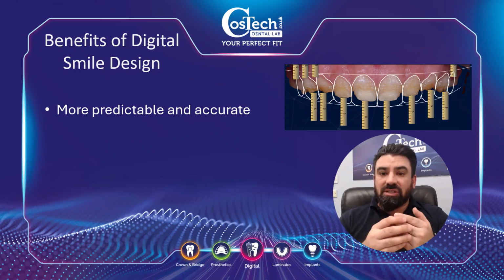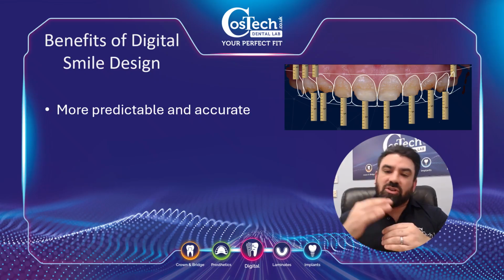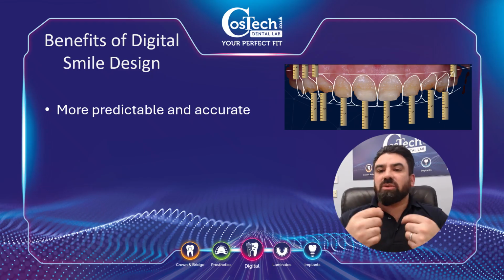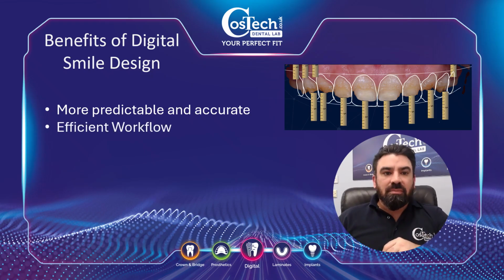But with this way, we can say, okay, we're going to go with potentially a zirconia crown. We know that we can't go less than 0.3 mil, so the computer already has that parameter set in. If you say to us, okay, I want to be minimally invasive on this area here, I don't want to take anything more than half a mil off, we can actually put that into the system. It becomes a very efficient workflow.